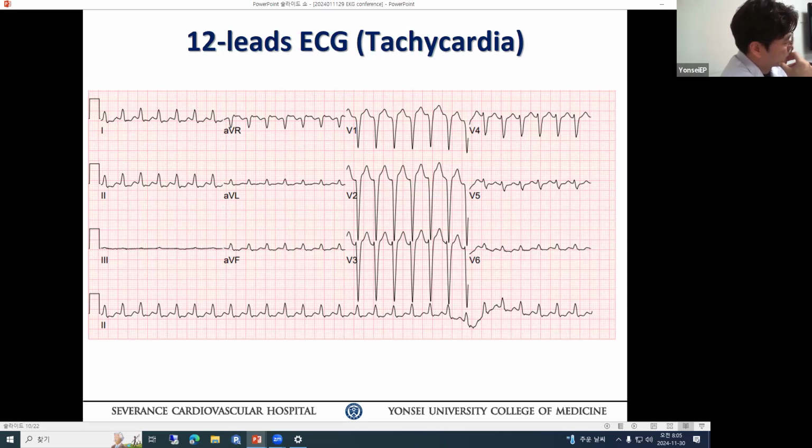So less than 18 seconds. Let's see here. But we exclude that.